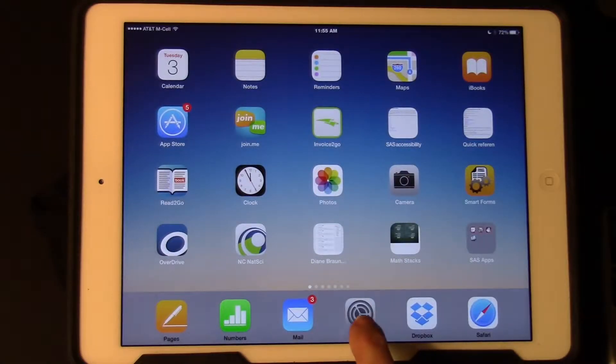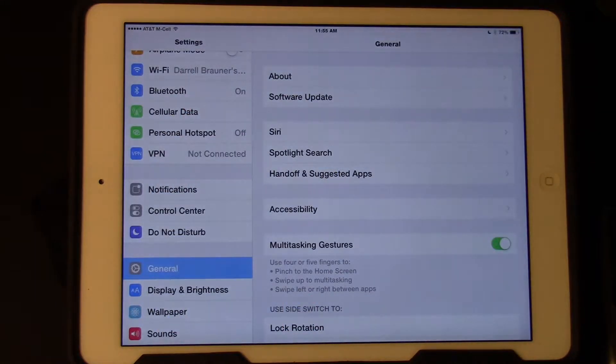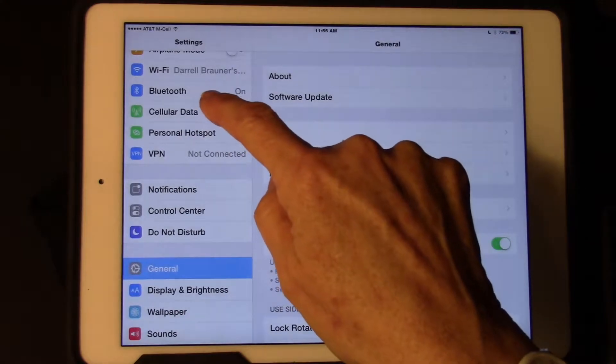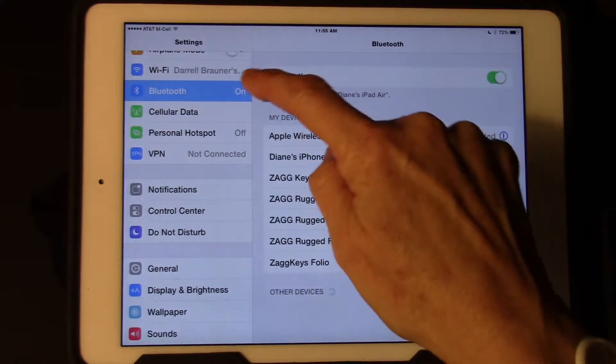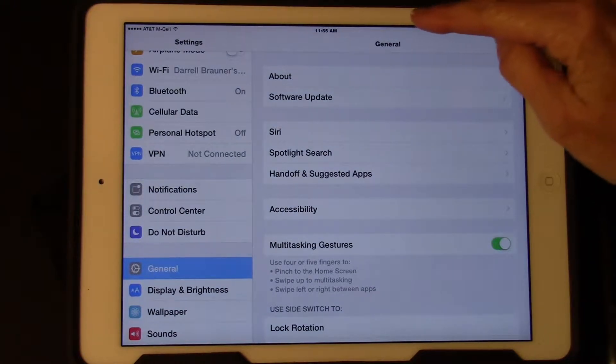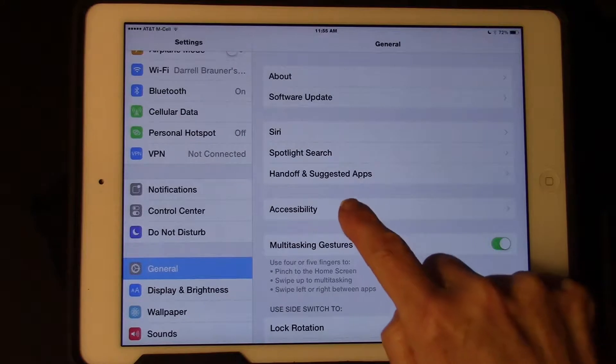We're going to go into Settings. On the left third, we're going to tap on General. You cannot pair a refreshable braille display going under Bluetooth — you must be in General. On the right two-thirds side of the screen, you're going to come down and tap on Accessibility.